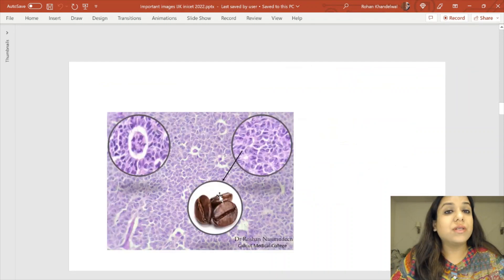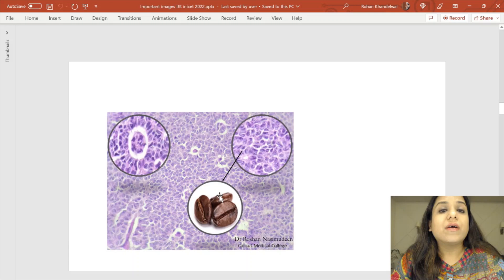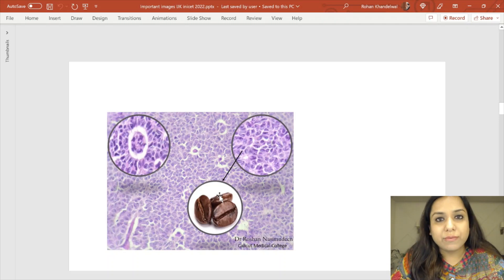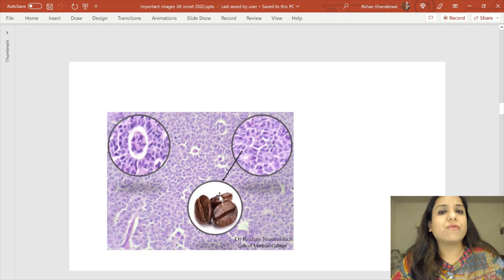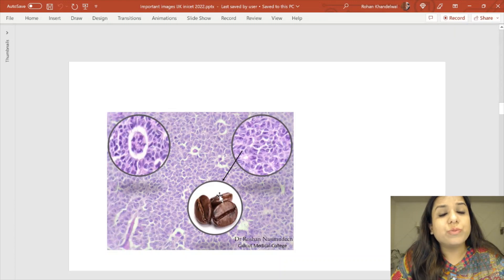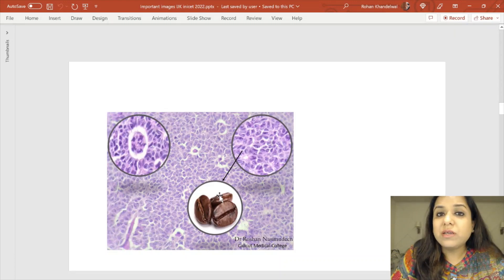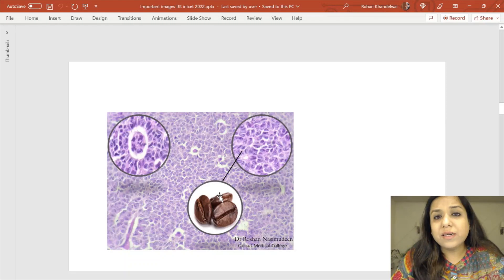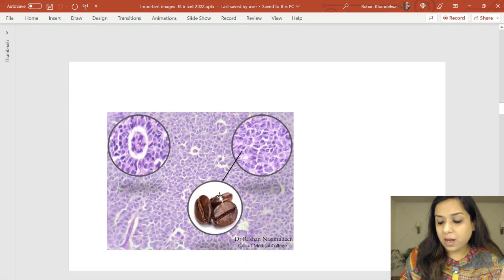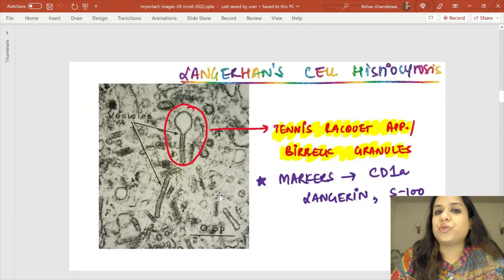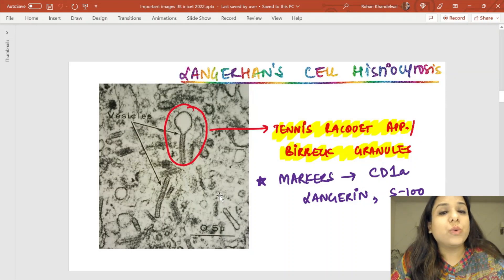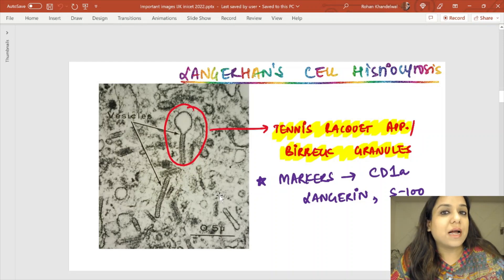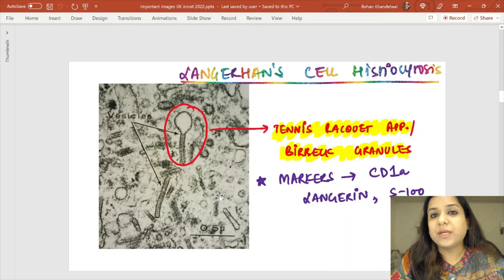On light microscopy, you see nuclei with a longitudinal groove — called coffee bean nuclei. Many tumors have coffee bean nuclei: Brenner's tumor, granulosa cell tumor, papillary carcinoma of thyroid, and Langerhans cell histiocytosis. The markers for LCH are CD1A, Langerin, or S100 positive — very popularly asked in MCQ exams.